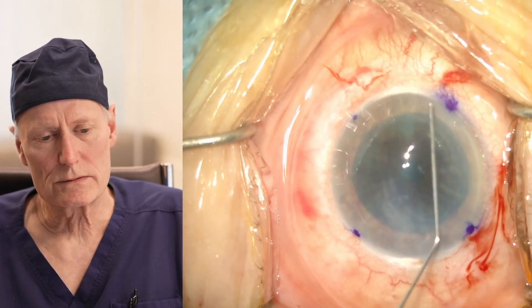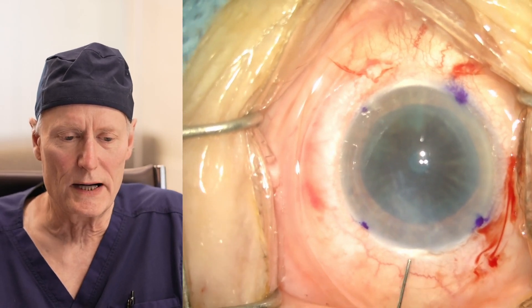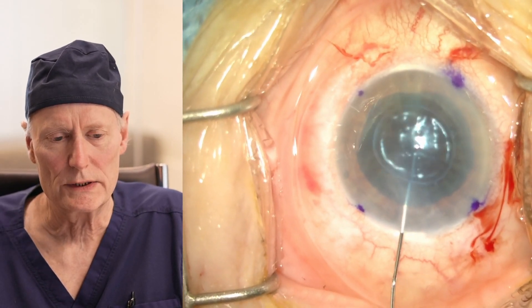This is really the end of the surgery. Now we want to hold the cells that we've transplanted in the eye with some air, and that's what we're going to do here.